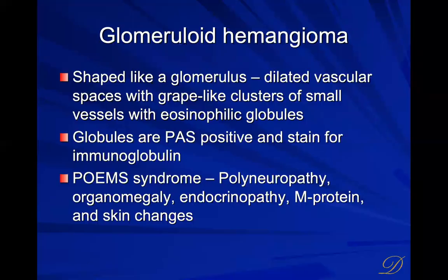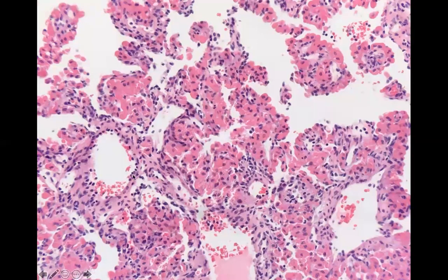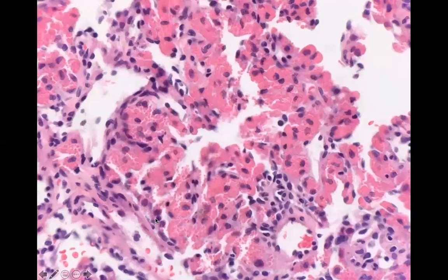A glomeruloid hemangioma is lobulated and shaped like the glomerulus of a kidney. It has dilated vascular spaces with grape-like clusters of little vessels containing eosinophilic globules, which are actually immunoglobulin. These are seen in association with POEMS syndrome: polyneuropathy, organomegaly, endocrinopathy, M protein, and skin changes. The globules inside the cells are M protein staining with immunoglobulin, not blood.